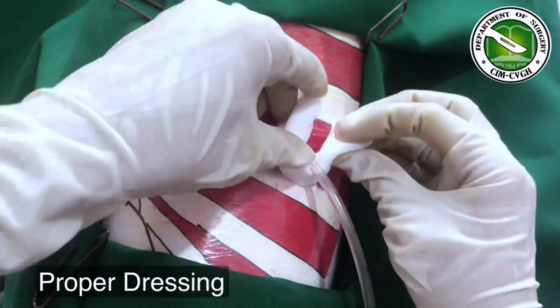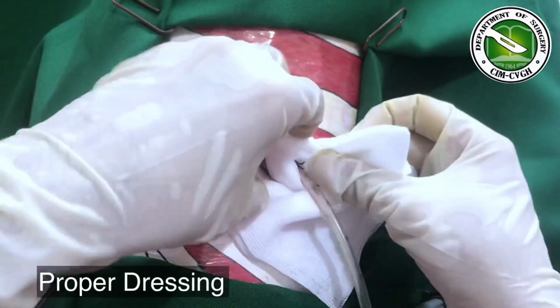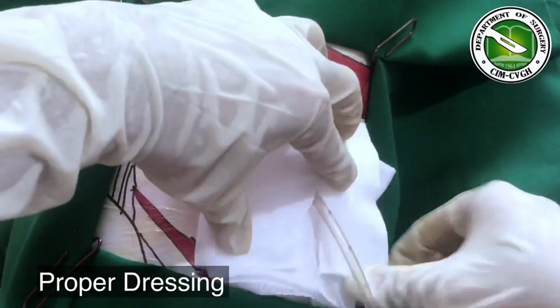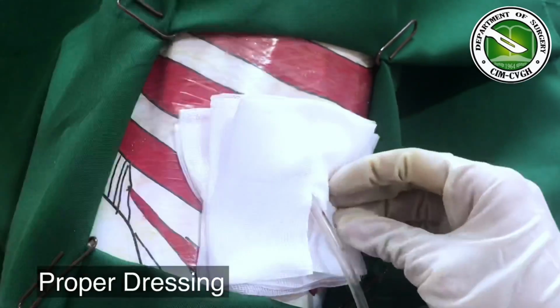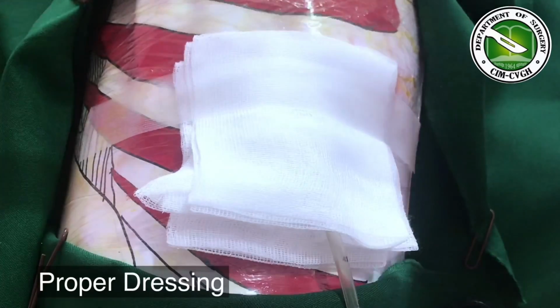Place Vaselinized gauze dressing around the tube. Next, cover the tube using 2 4x4 gauze with a slit in the center and place them 90 degrees against each other to prevent them from sliding off the tube. Plaster the dressing in place.